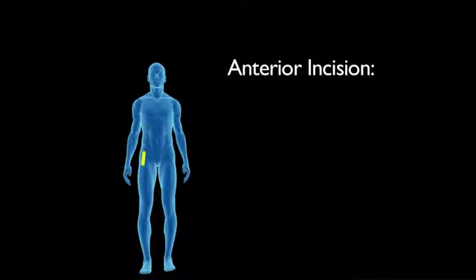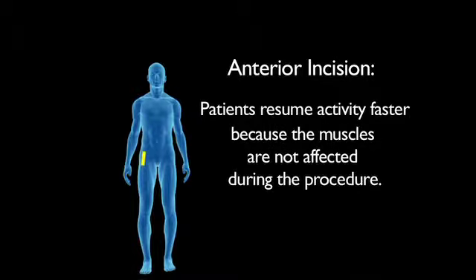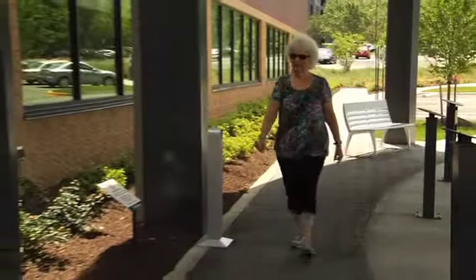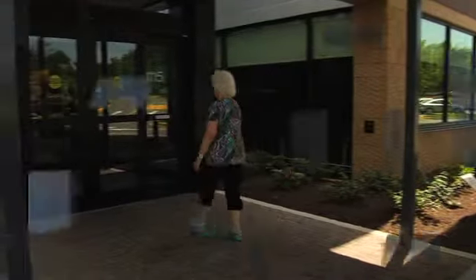Total hip arthroplasty is the most successful procedure that we do in orthopedics. Whether you do the incision up through the front or the back, they all do well over time. However, if you do the incision up the front, the studies have shown that they actually get up and move quicker. It's a muscle sparing approach, and by doing it up through the front, you can do it through a very small incision and you don't operate through the muscles that you use to walk with. It gives you more stability and it gives you longer wear over time.